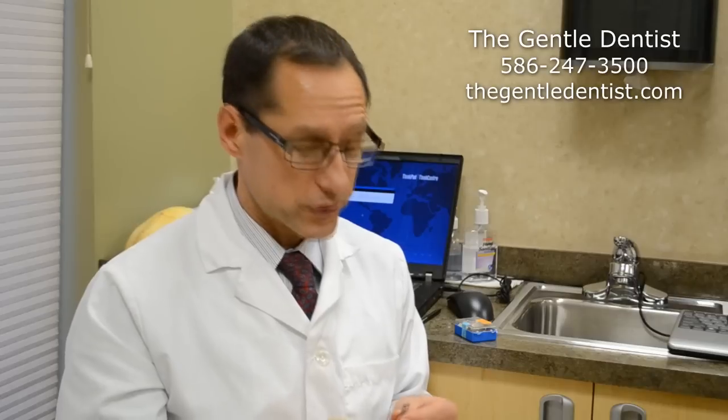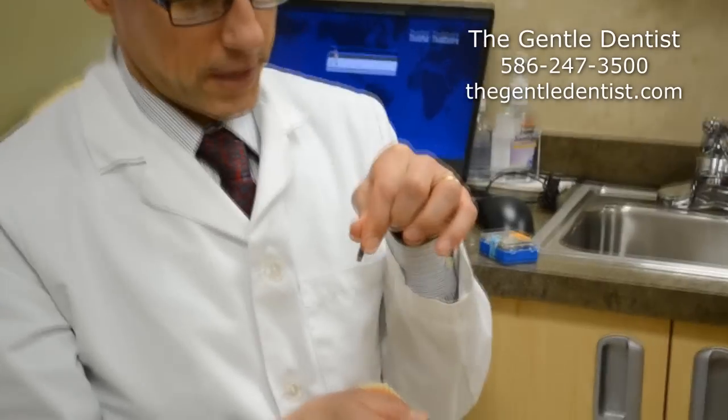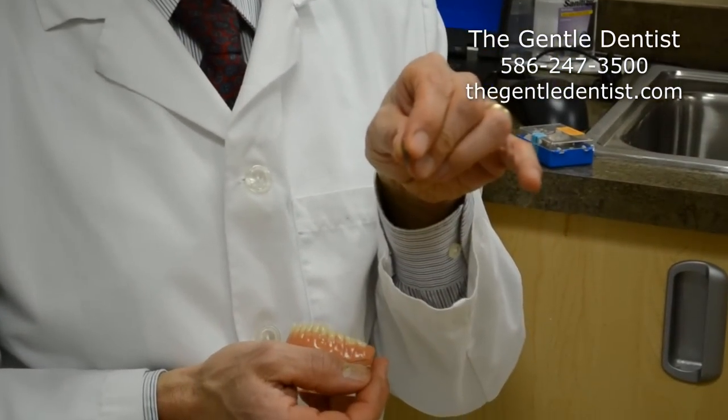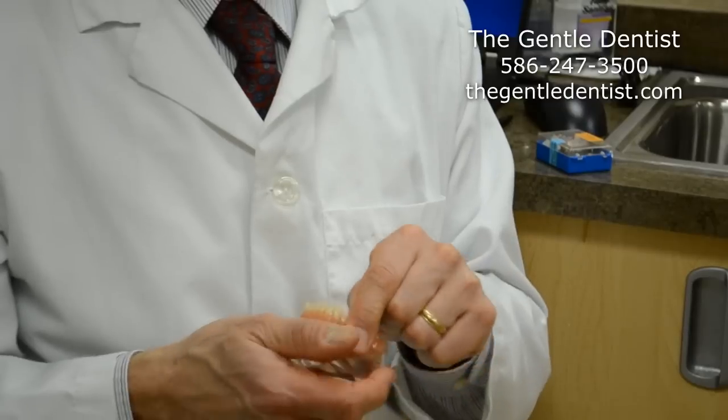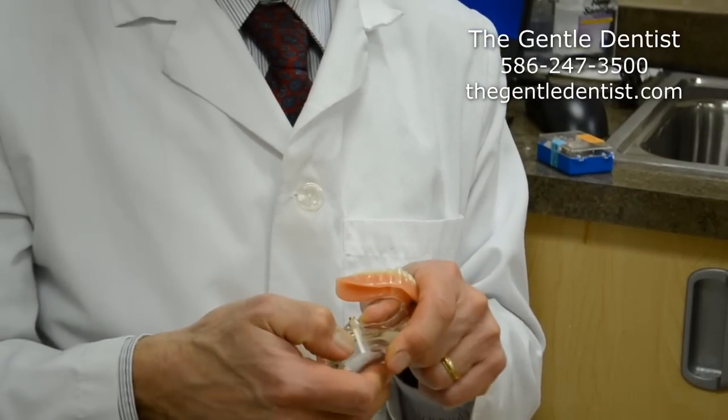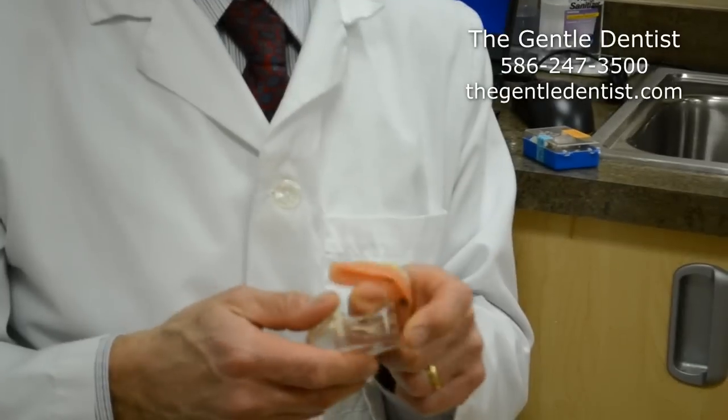Implants are a big part of dentistry now, as most of you have heard about implants. What I wanted to do is just compare, for the situations where we would use something to hold a lower denture in place, the difference between a full-size implant, which I'm holding right here, compared to what's called a mini implant, which is right here. We can also use a natural tooth — you can see the root of the tooth here — to actually hold these in.